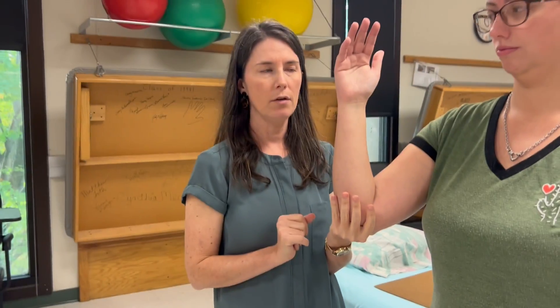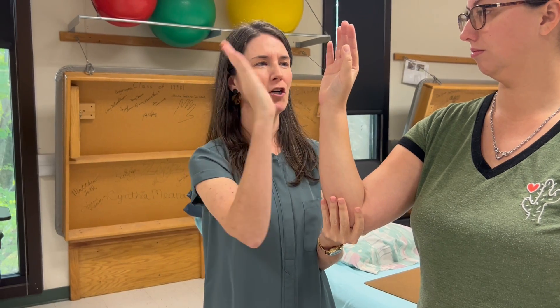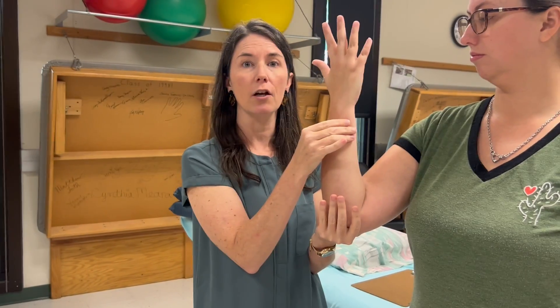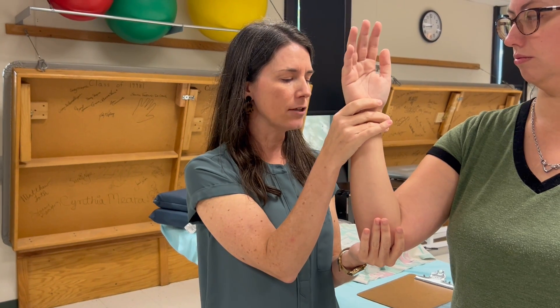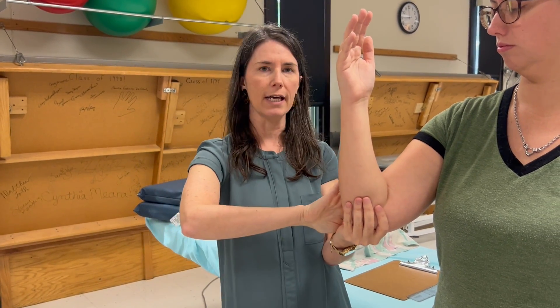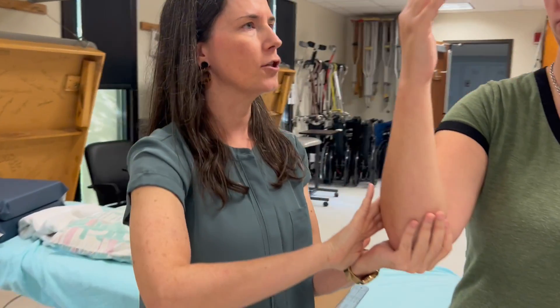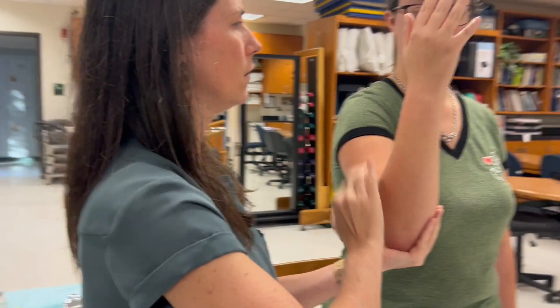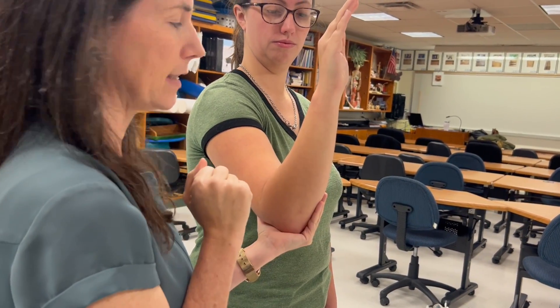If she can't do that, I need to get her into a gravity-eliminated position and support the elbow. For supination gravity-eliminated, have her turn palm toward her — that's her grade two. If she can't do that, I'm palpating her supinator muscles on the dorsal side, just proximal to the head of the radius, and have her try to turn palm toward her. If she can't do it but I can see or feel something happening in the supinator, we give her a one. Nothing is a zero.